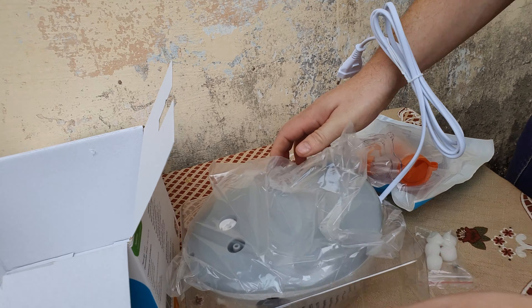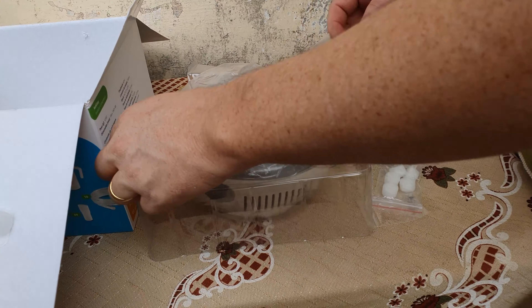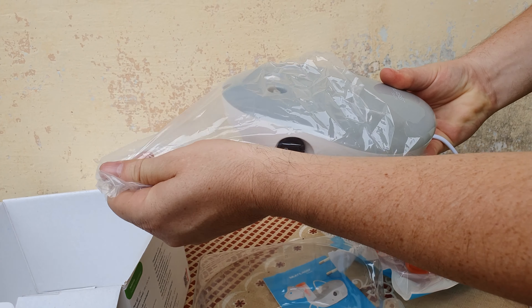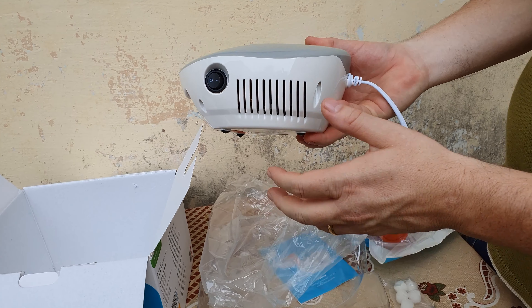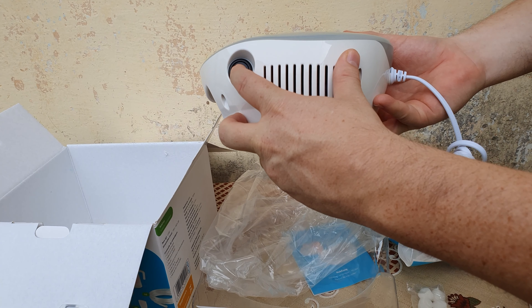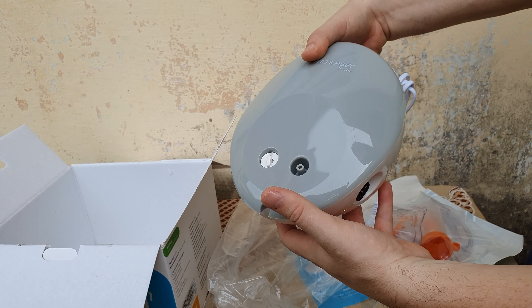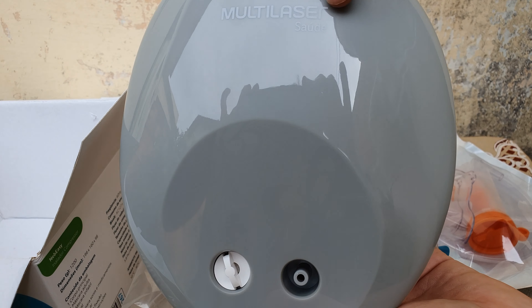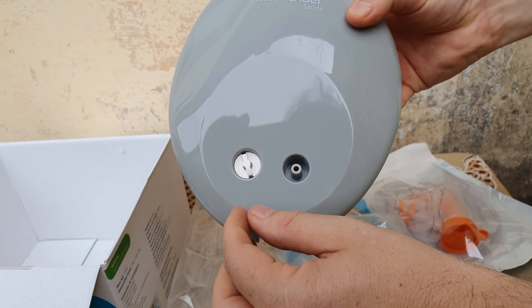Como vocês já viram o box aí, eu fiz lá na casa da minha mãe e ficou bem legal, ficou bem clara a imagem. Primeiramente, vocês podem ver que ele vem todo embaladinho. É um aparelho bem pequeno, não é tão grande. É um aparelho seguro, com botão de liga e desliga, que é muito legal. Tem a marca aqui da Multilaser — é uma cor bonita que não suja tanto.